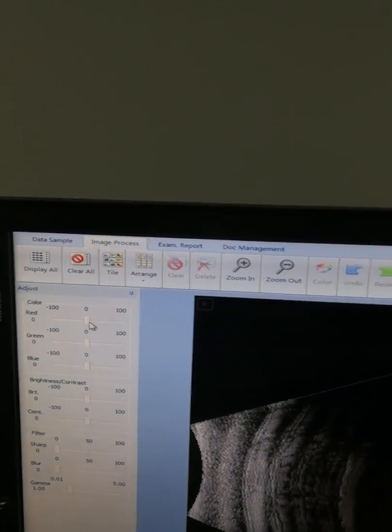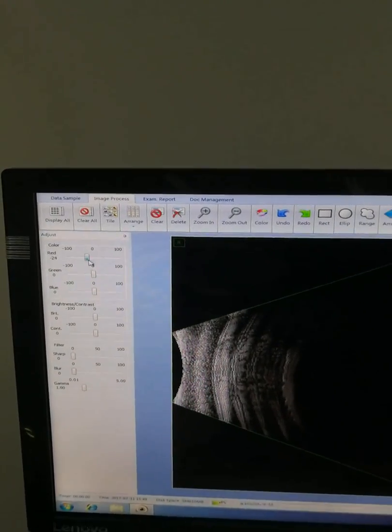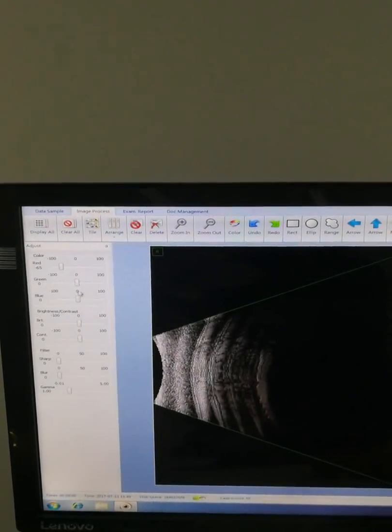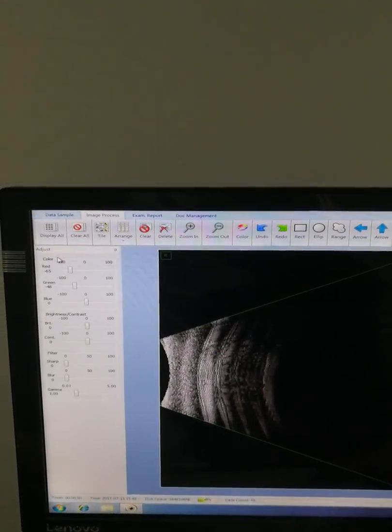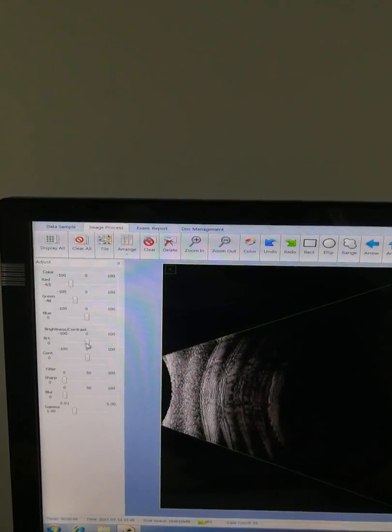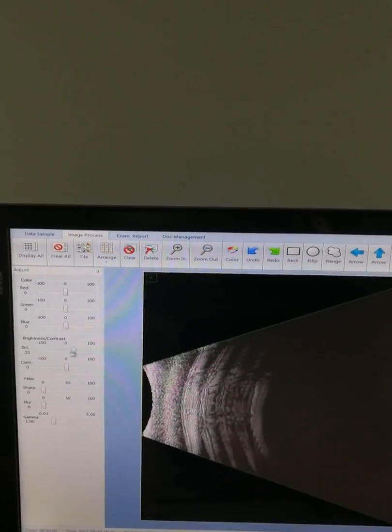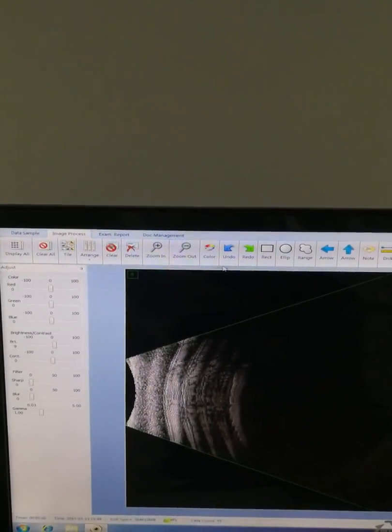Here's the image process section. You can control and change the image color and brightness here.